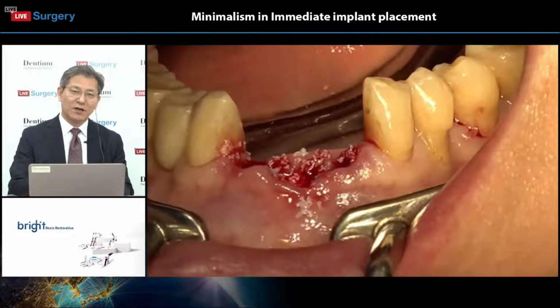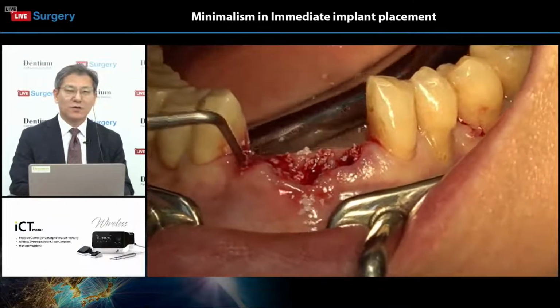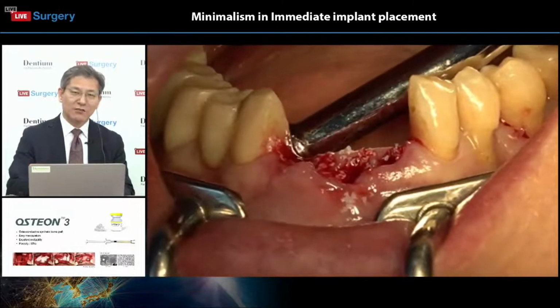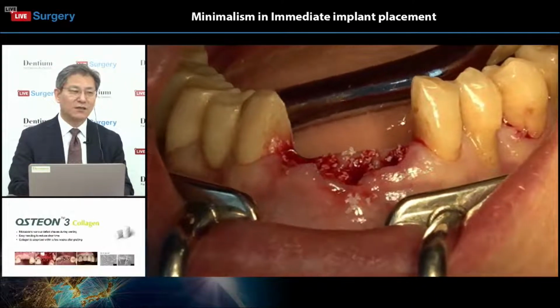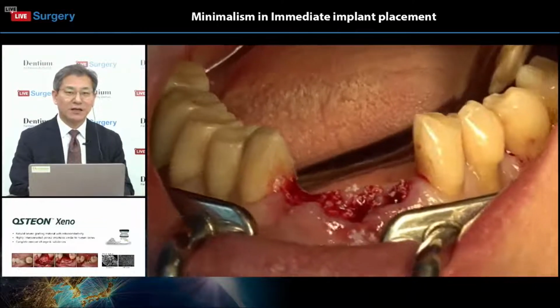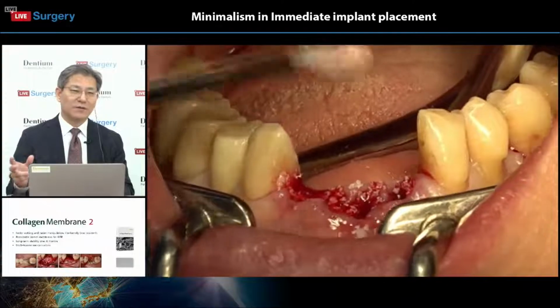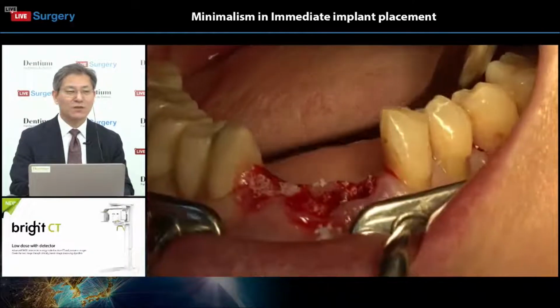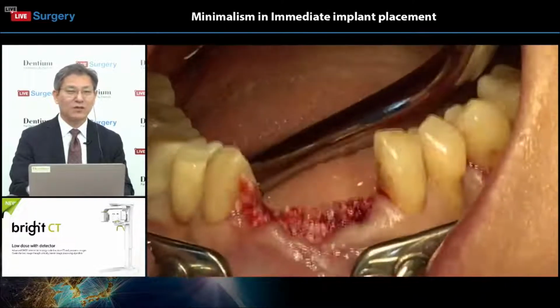Someone wants to have autogenous bone grafting first, and then the bovine, like a xenograft. That means a combination technique, like a layer technique. But someone else just uses bovine bone or some alloplastic bone, it doesn't matter.